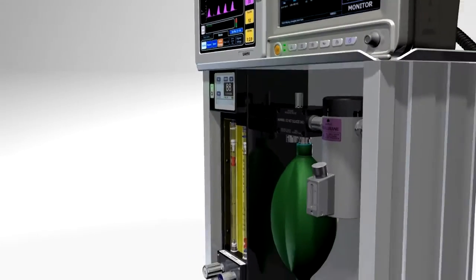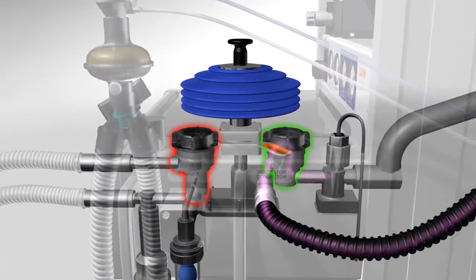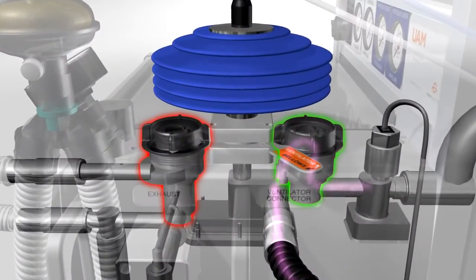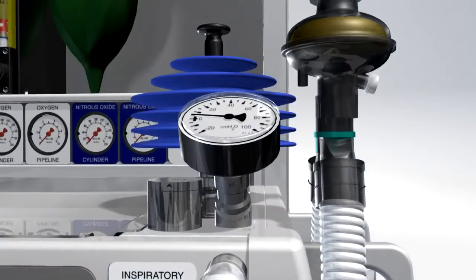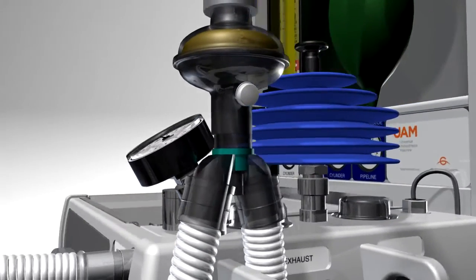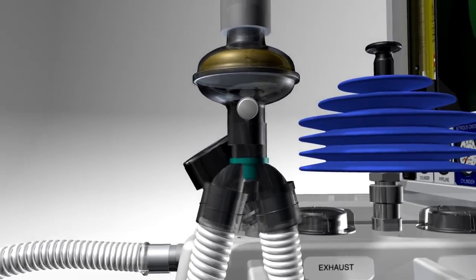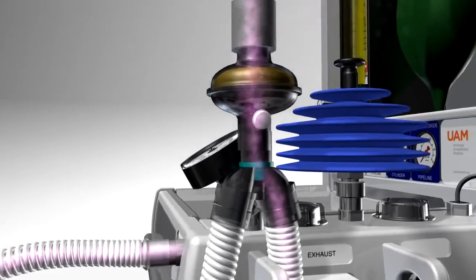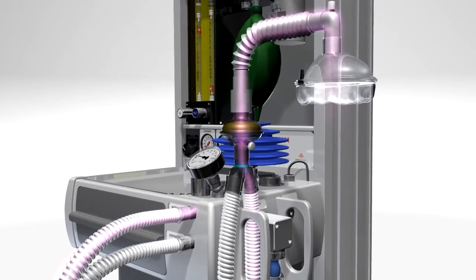Anesthetic gas is delivered to the breathing block and through the one-way valves and inspiratory limb, in the same way as the manual bellows shown earlier. The UAM uses a conventional Y-piece patient connection. The anesthetic gas flows to the patient through the Y-piece connected to a face mask, endotracheal tube, or LMA.